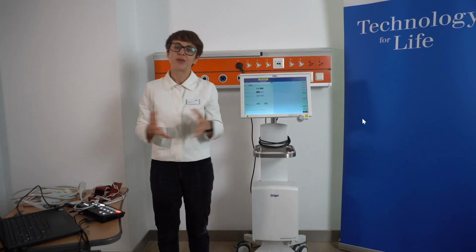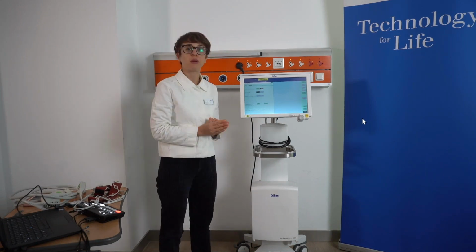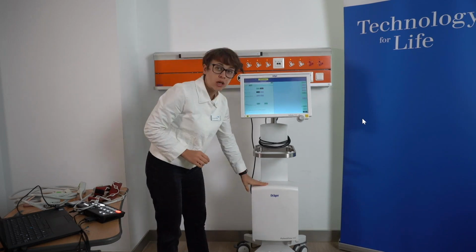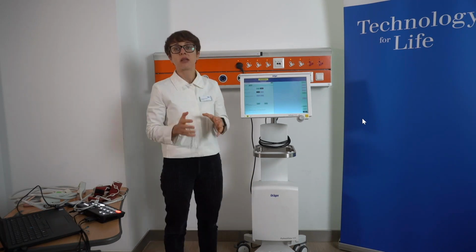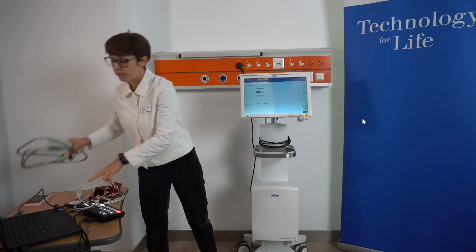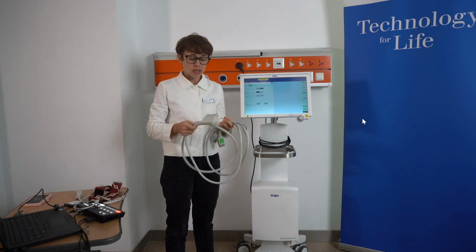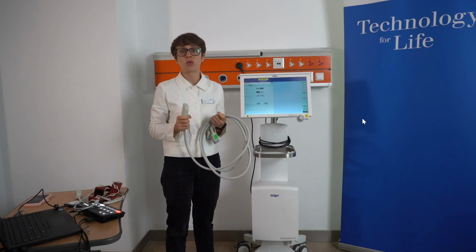Welcome everyone again. Here in front of me, I have the PulmoVista 500. We have the main control unit, we have the cockpit, and then we have a number of accessories that I would like to introduce to you. To start with, the main accessory is the cable trunk. Using this trunk cable, we are able to take the measurements.